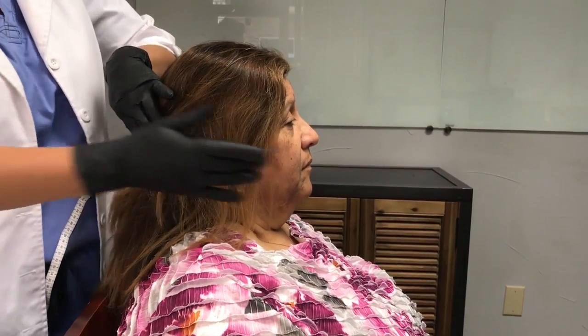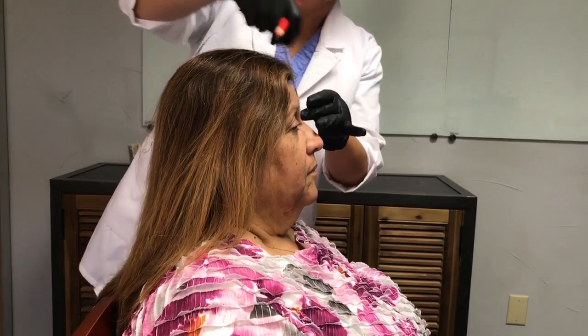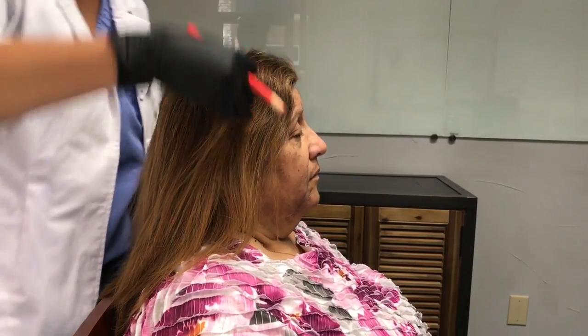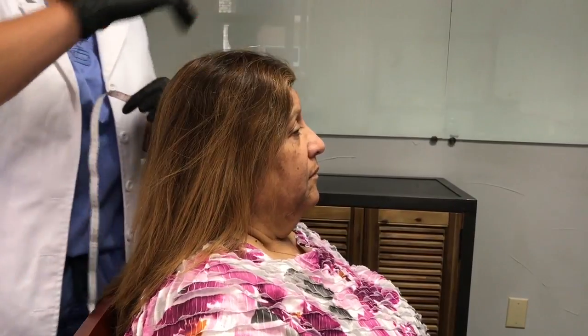The third and fourth landmarks are the preauricular points anterior to the ear. I will now demonstrate these measurements: nasion to inion, preauricular to preauricular. These would be followed by my measurements of the circumference of the head, the frontal plane, the parietal plane, and the parasagittal planes.